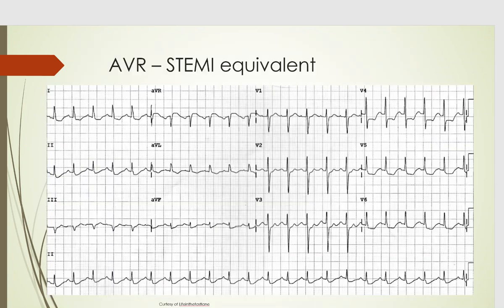Here's another EKG I found on the internet. This one has definitely greater than two millimeters — looks like about three millimeters of ST elevation in AVR. Then you look at V4, V5, V6: all have ST depression, as well as lead one and lead two. This fits the criteria for an AVR STEMI equivalent. I don't have clinical information on this patient, but you want to clinically correlate — though this one is pretty obvious.